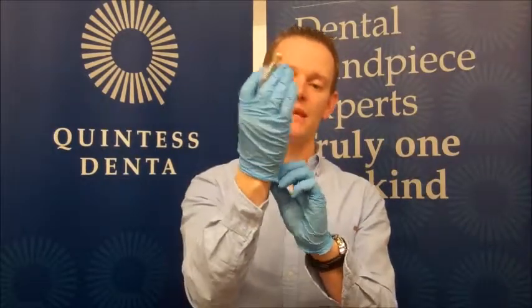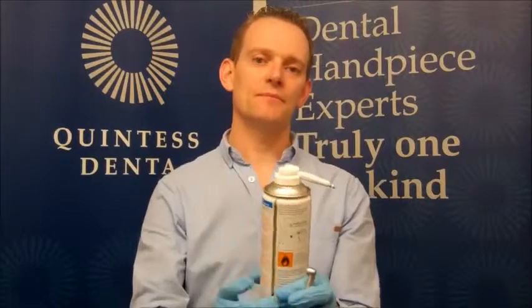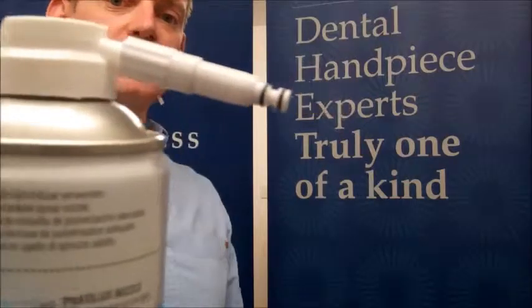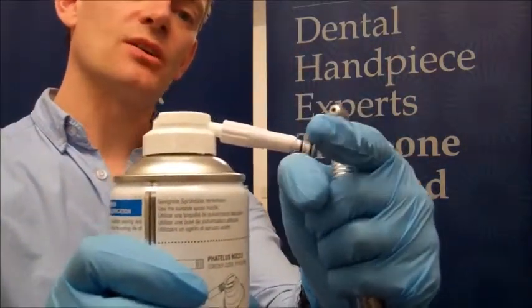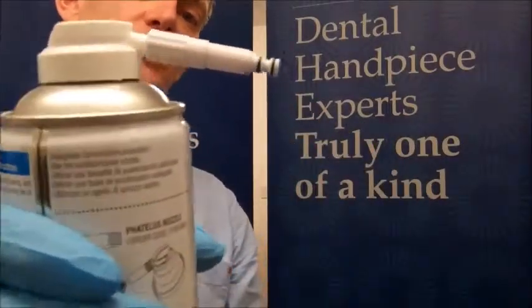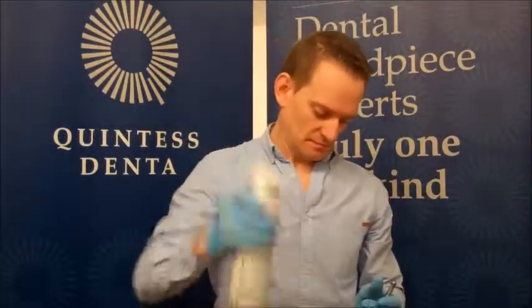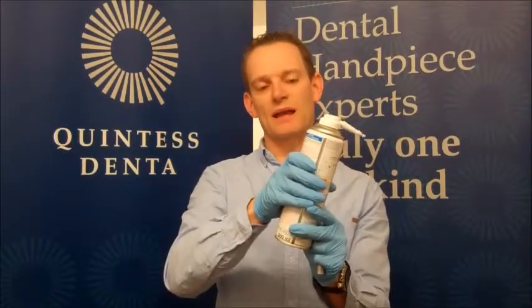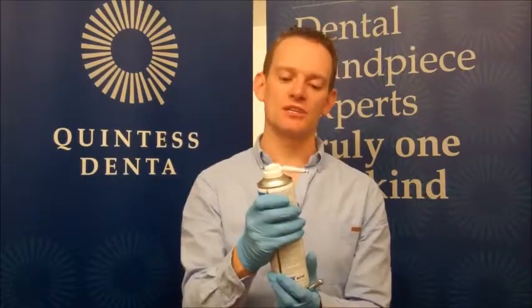Firstly, you need to have the correct PPE on, such as gloves and a mask. We then take a good quality lubricant oil and make sure you've got the correct nozzle — this nozzle is for a KAVO handpiece and you need to make sure that the little O-rings on here are not frayed or perished. Take the oil and shake it vigorously. That will mix the propellant gas and oil inside. If we didn't do that, we would get the propellant gas out first, which causes contamination issues.